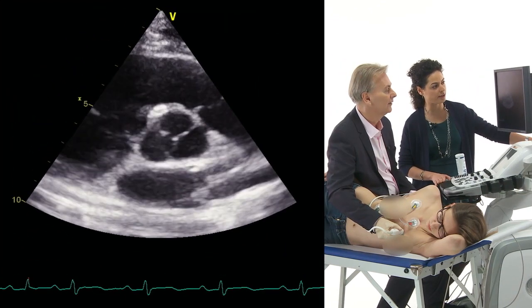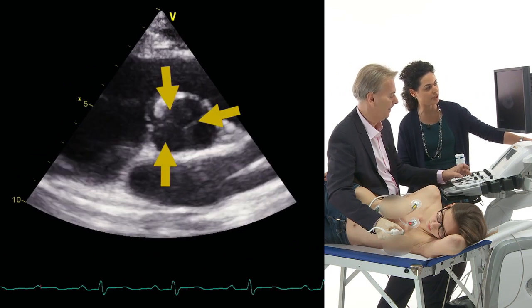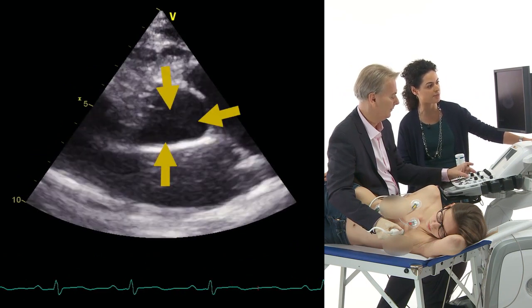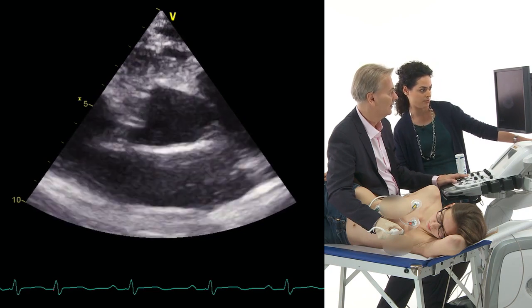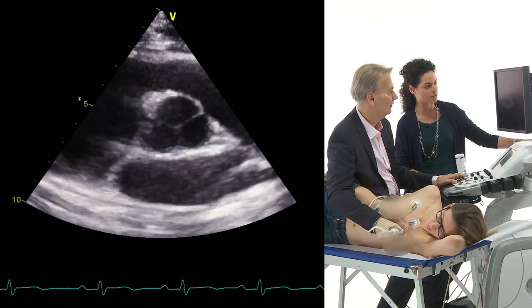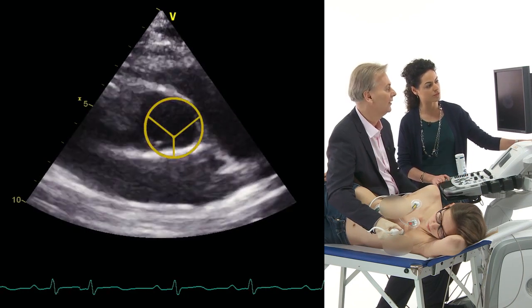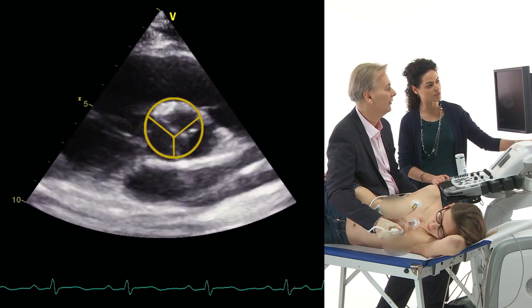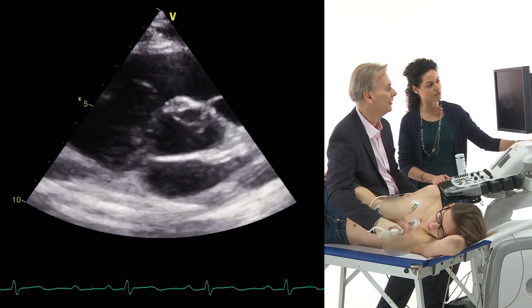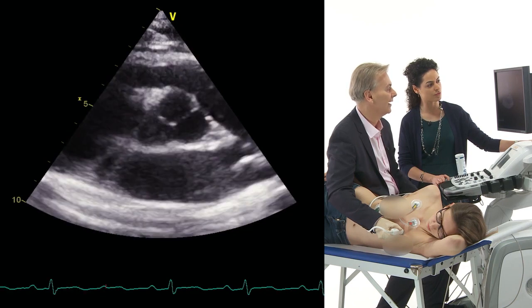Oh, this is great. We actually can see the three cusps opening and a really nice tricuspid aortic valve. Yes, you see the three cusps. And we usually say they look like the Mercedes star. This is how we check whether or not the valve is really imaged the way it should be. Some also say it's the peace sign.